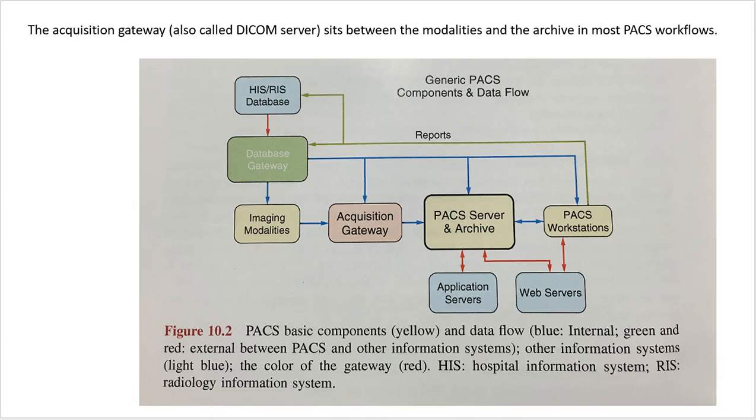Okay, let's continue with our image acquisition gateway talk. So modalities, gateway, PACS.